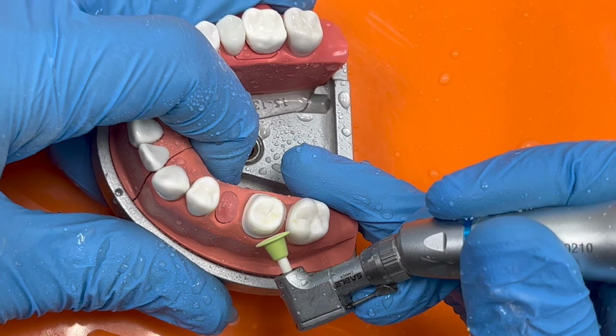Then, I use a polishing strip that I cut in half vertically and go over the inner proximal margin to make sure no unsupported enamel is present there.